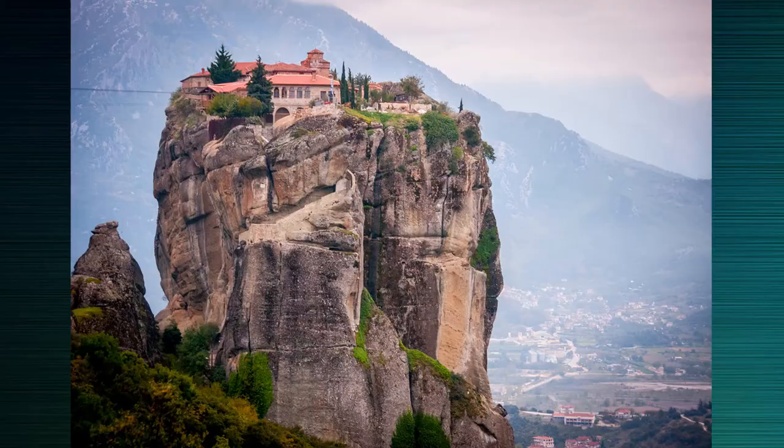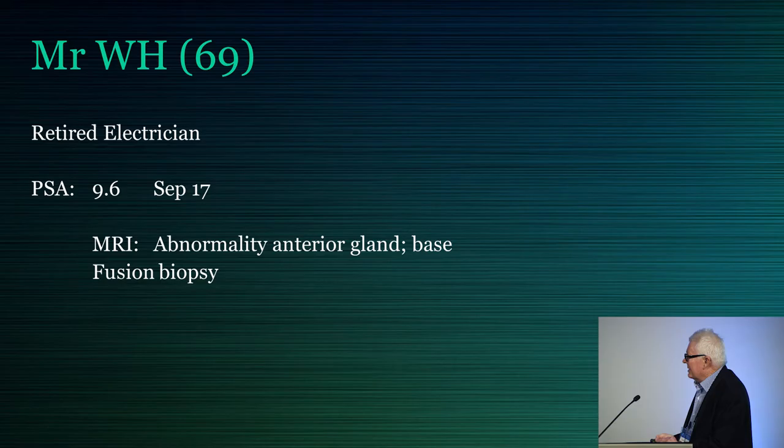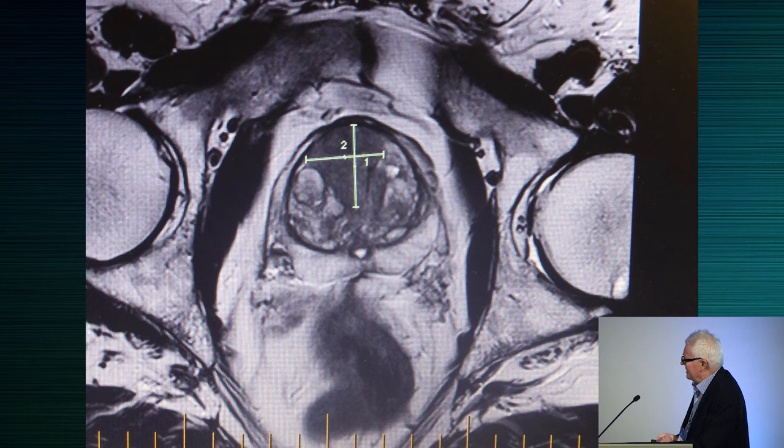Now, some of the prostate is very difficult to access, as Rod has alluded to. And just to give you an example of this, this fellow had a high PSA reading and a very clearly seen abnormal focus here on the MRI scan, quite at the front of the prostate, anteriorly. Here's the hips here, pubic bone here. So this is traditionally a very difficult site to get to with standard transrectal ultrasound guided biopsy of the prostate, and many of these are missed with TRUS biopsy.